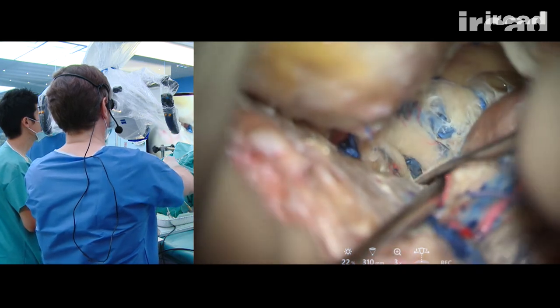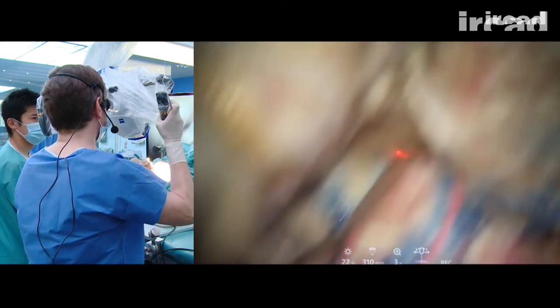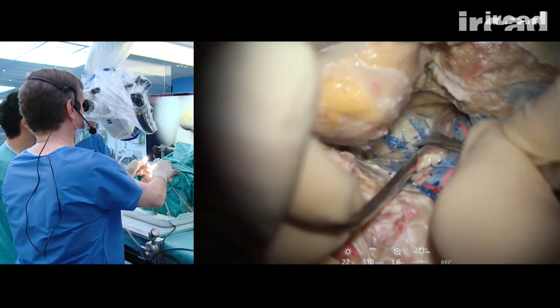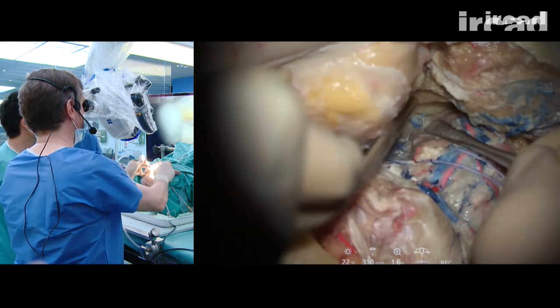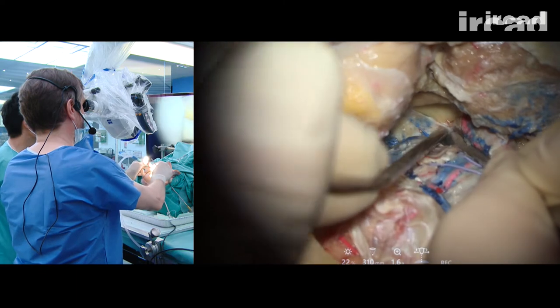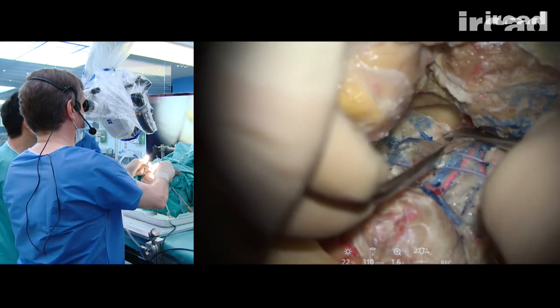This is V1, V2, venous plexuses, venous channel of the cavernous sinus. If I keep going downward here, I see V2. And if I keep going backward, I will expose V3. This is the beginning of V3 here on foramen ovale.